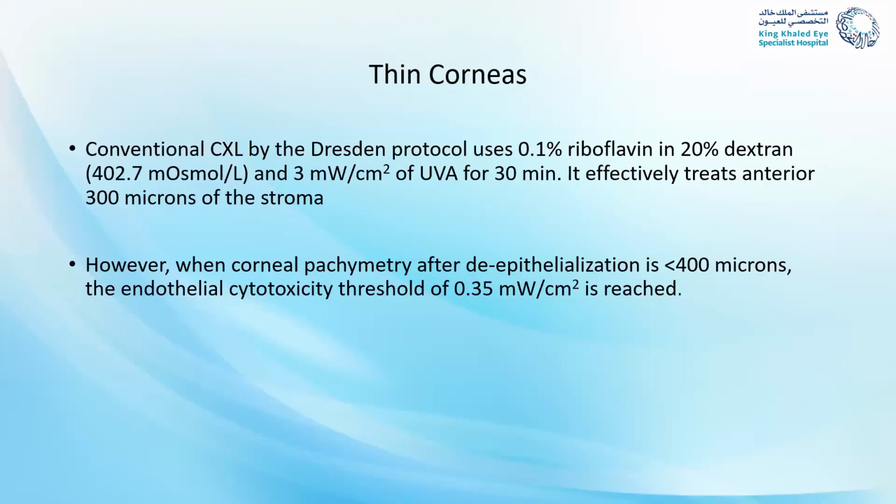thinner than what they are recommending, it means that there is a higher chance for the endothelial cytotoxicity threshold of 0.35 milliwatt per centimeter squared to reach the endothelium. So this level of toxicity is reached once this safety margin is crossed.